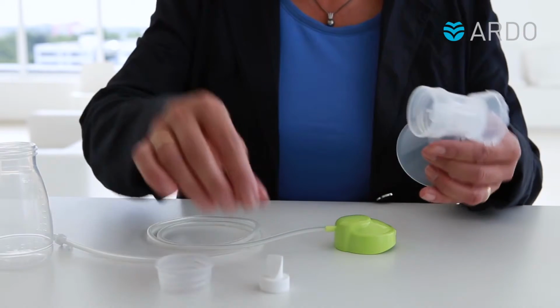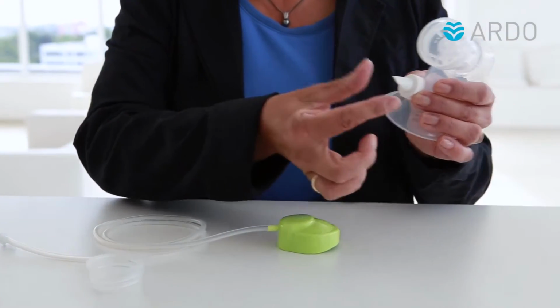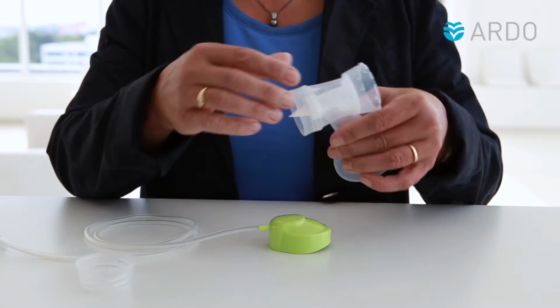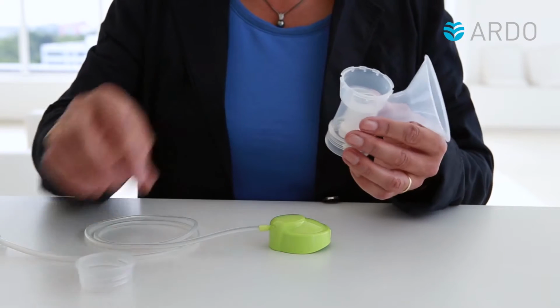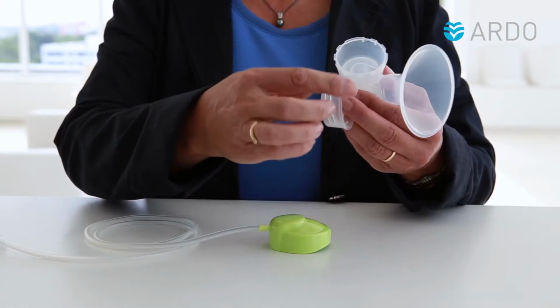Grip the white valve on the reinforced sides and put it into the breast shell. Before assembling, inspect the valve for any tears or milk deposits. Now place the membrane pot in the breast shell with the smooth side facing outward.